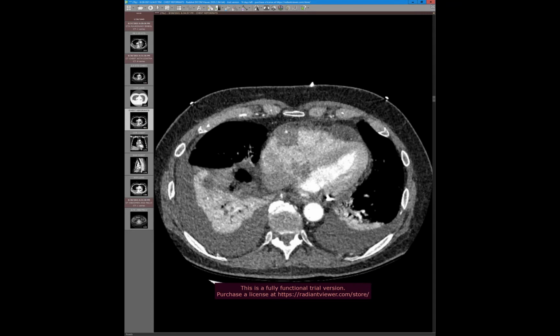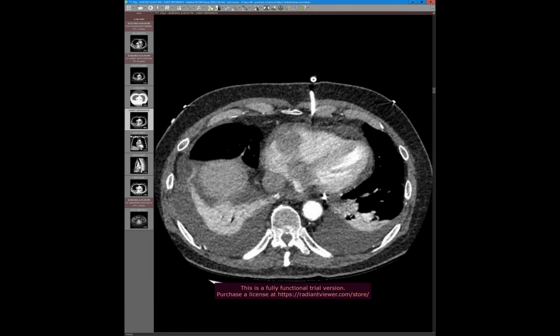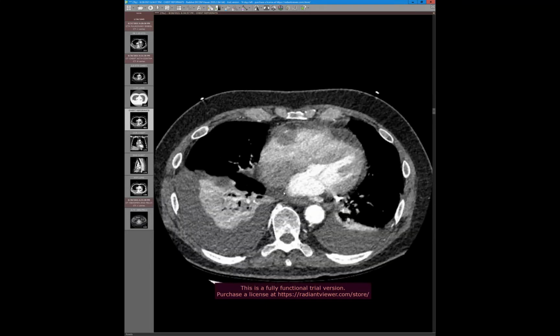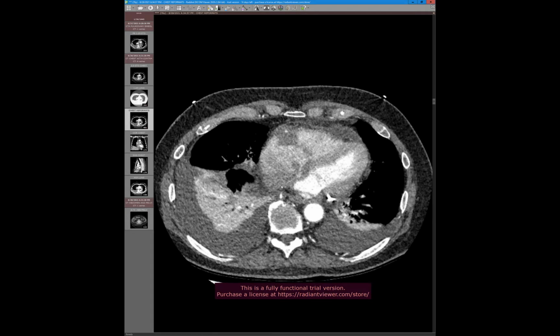Seth, one other question too, because I was thinking, like you said, this looked more like lymphoma. The other thing is, don't angiosarcomas usually derive their blood flow from the RCA, and it's often dilated as a result because of increased flow? At least a couple of the cases I've seen, that's been the case. No, I have a lot of cases with beautiful parasitization of RCA flow on CT and cath, and in those cases, the RCA isn't that dilated. You see a lot of little.